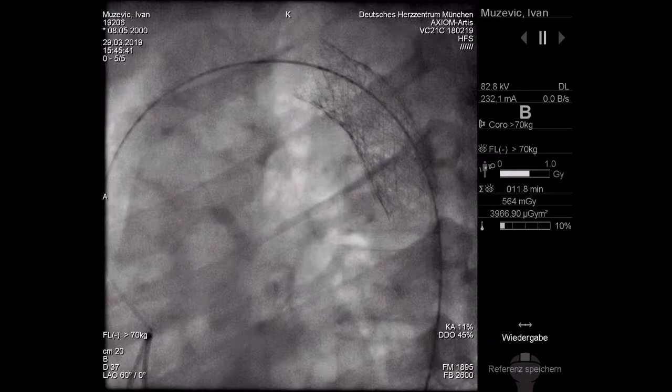Okay. So what pressure did you use at the end? Go till what? What did we have? 10, I think, right? 10. Pressure? Okay. Maximum pressure? So that's the difference. 12. 12. Okay. Yeah.